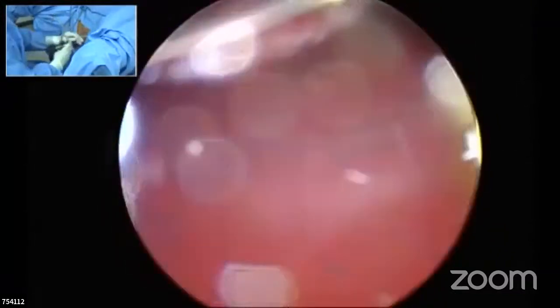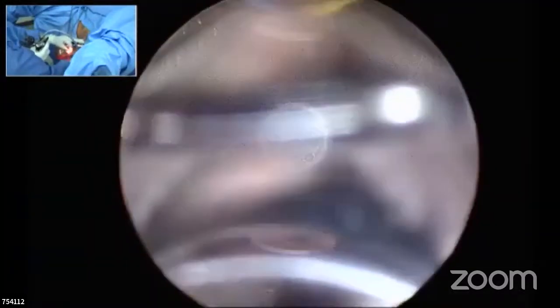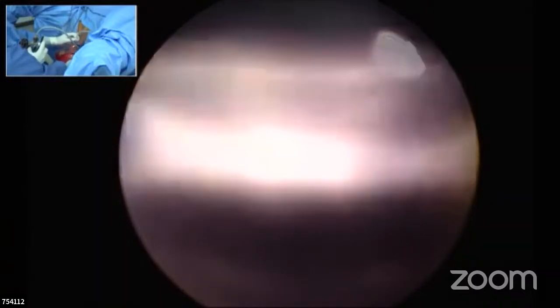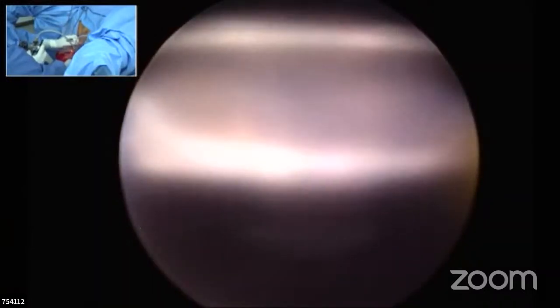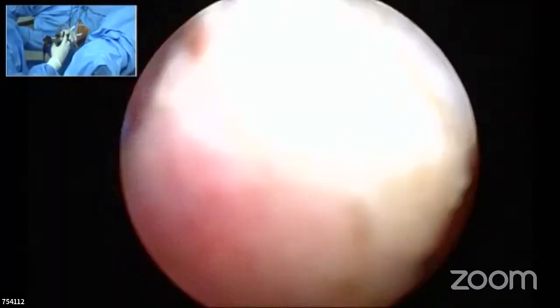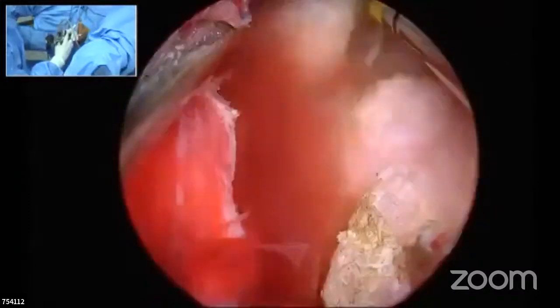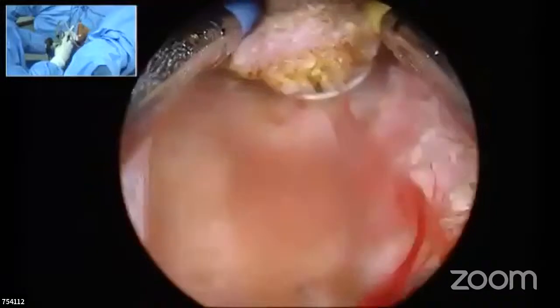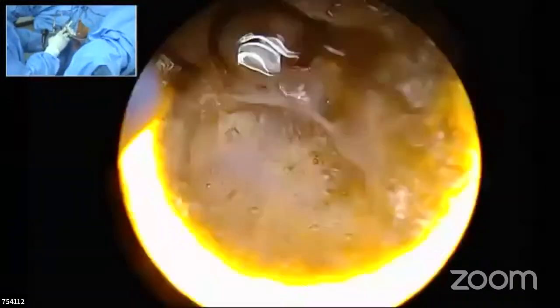So in this way of doing it, the advantage is you will not be reaching the capsule very early. You will be resecting an adequate amount of the gland before you reach the capsule. So getting into trouble initially itself is going to be very uncommon in Barnes technique. So that is safe. This is what was devised when it started. So you start resecting below, next one, and next one.